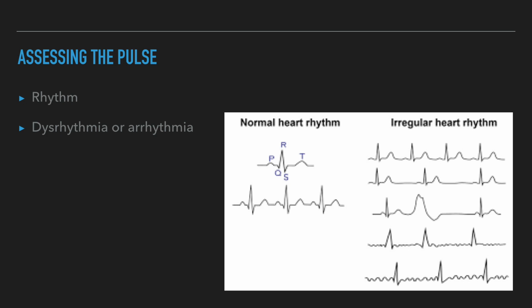In atrial fibrillation, the atria do not contract in a synchronous fashion, and the primary impulse for the heartbeat does not come from the SA node. Consequently, the time interval between successive ventricular contractions varies, and an irregular pulse is detected. When you note an abnormal pulse rhythm, consider using the auscultatory method to obtain an apical pulse rate. Also, determine if irregularity of the pulse is a new finding for the client.